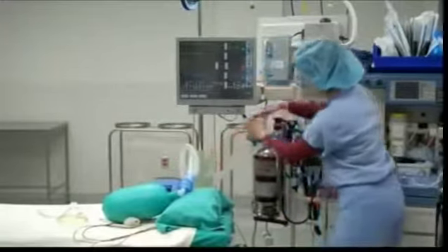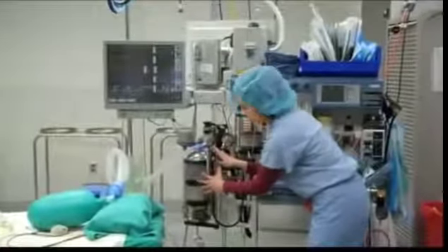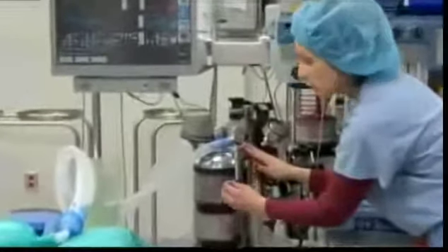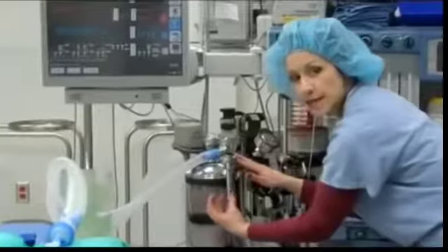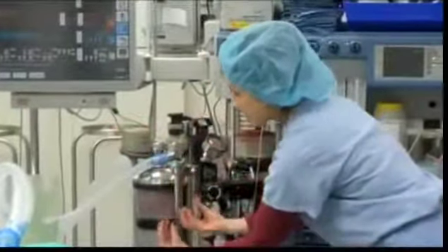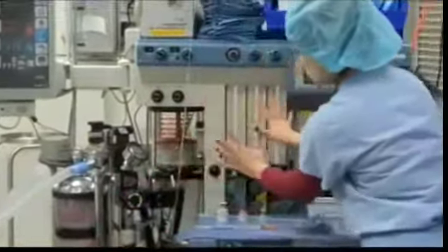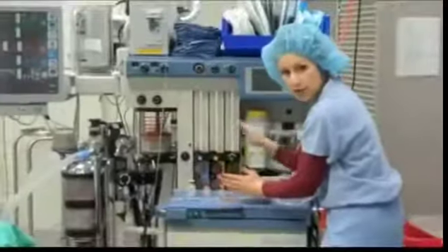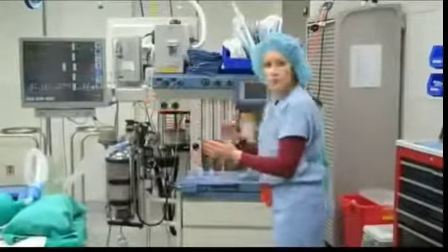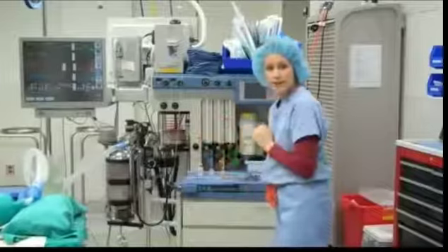And it continues to travel then into these canisters with the pellets that you see. These canisters are called carbon dioxide absorbents, okay? And what they do is they extract the carbon dioxide from the gas that is coming from the patient, okay? The carbon dioxide is then removed, and the gas then is brought back into the machine and mixed with fresh gas and then sent back through. Okay? So this system is a closed system. Okay? And this is how we manage the patient's general anesthetic.